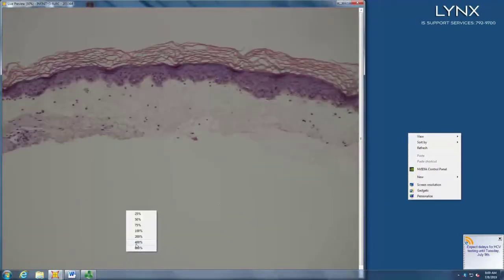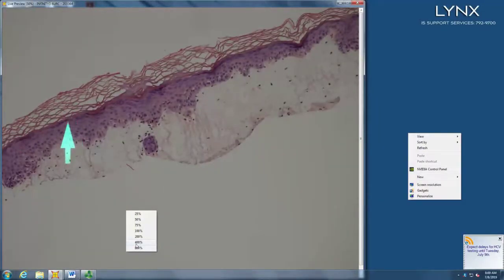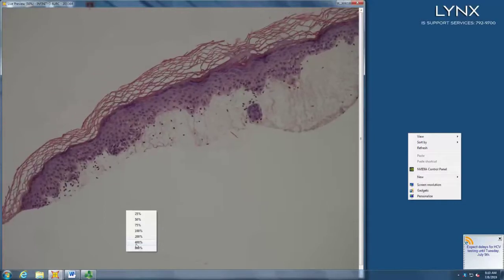So subepidermal edema, a layered horn, compact with basket weave above it. So the most likely thing you'd think of would be bullous, but in this case you also have dead reds at the junction. You have some vacuolar interface.